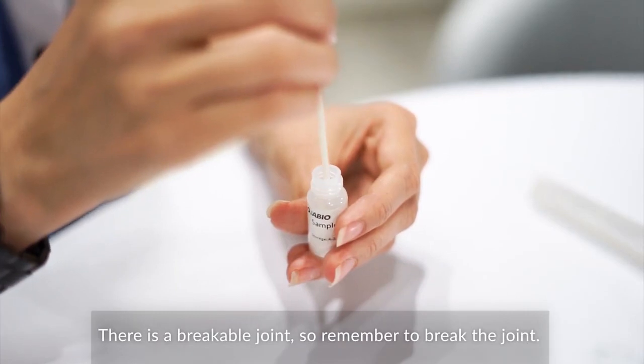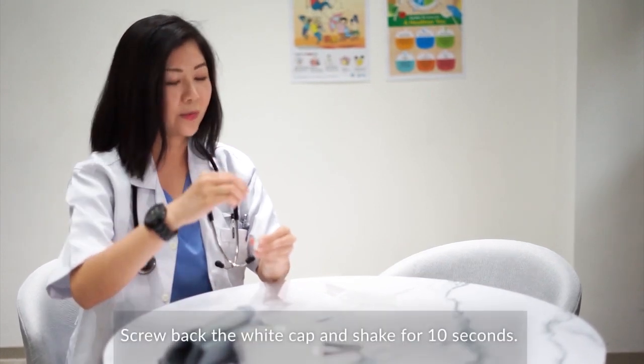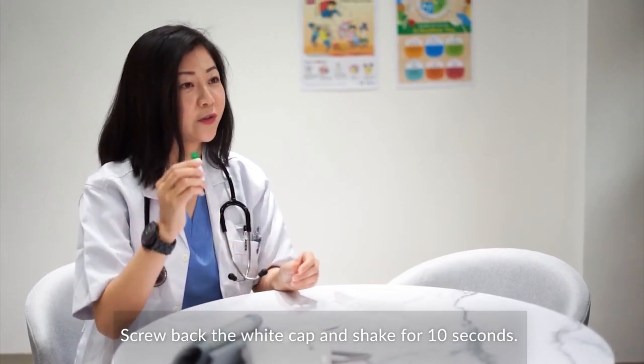There's a breakable joint, so remember to break the joint. Then screw back the white cap and shake for 10 seconds.